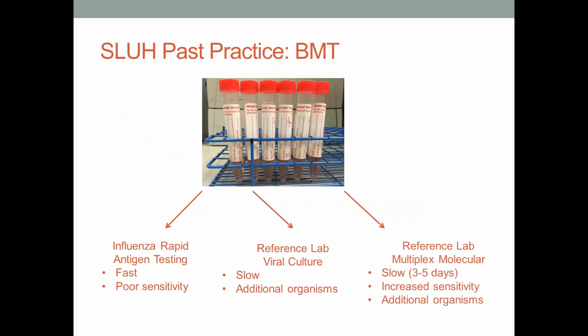So even though that test itself may be very fast, the time it took for that sample to get across the country and be tested and results to come back was taking 3 to 5 days. So even though there was this increased sensitivity and additional organisms that had been difficult to detect in culture, we still weren't really getting what we needed. And a lot of our physicians practice at other hospitals, and so they were experiencing in other places getting that rapid result back right away, and were really dissatisfied with what they were experiencing here.